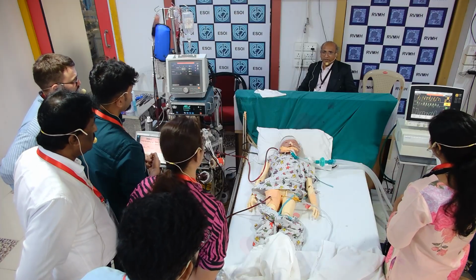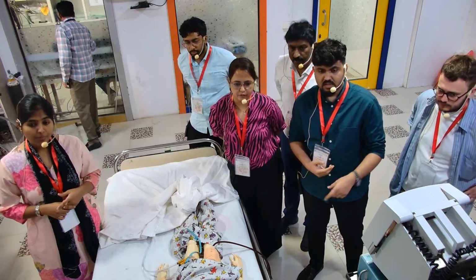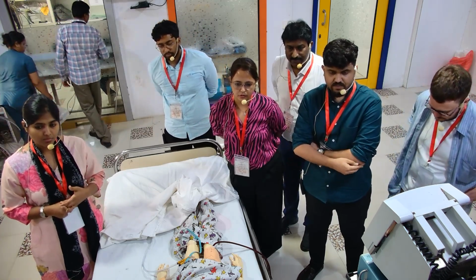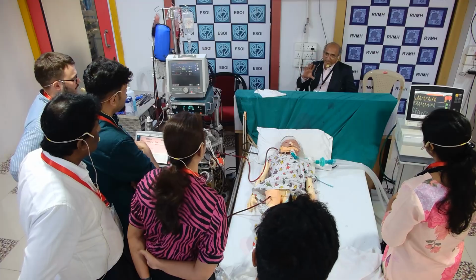So why did you think about the drainage cannula only? Why not the return cannula? Because the P1 pressure was more negative. The pressures were initially more negative, so we thought something was wrong with the drainage cannula first.